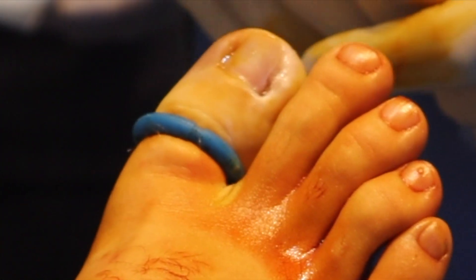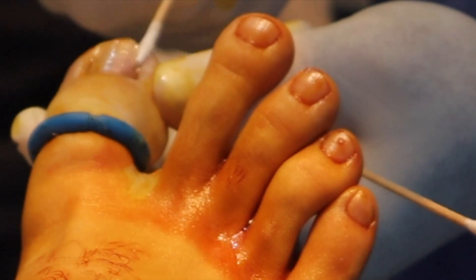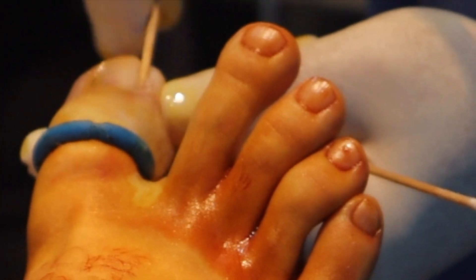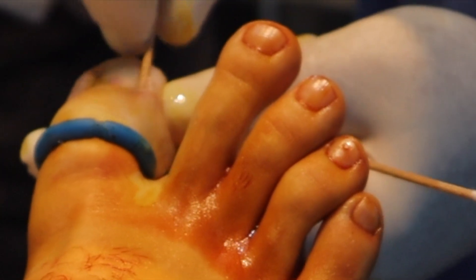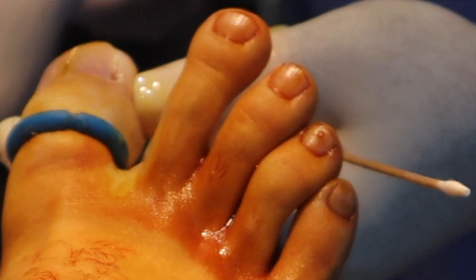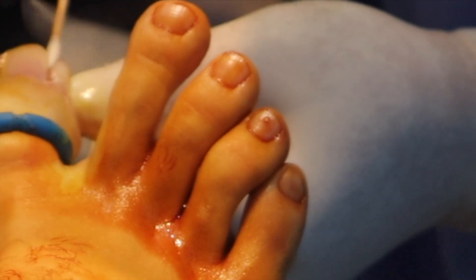Now we'll neutralize the chemical with some alcohol spray. That way we don't get any burns because the chemical is now neutralized at the root and the surrounding skin.